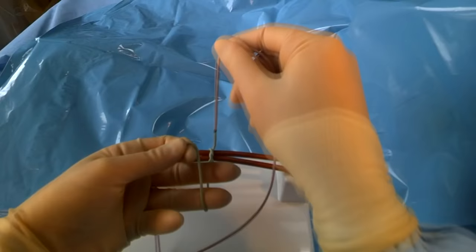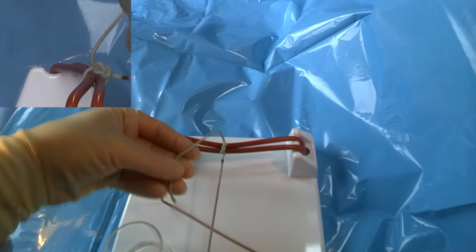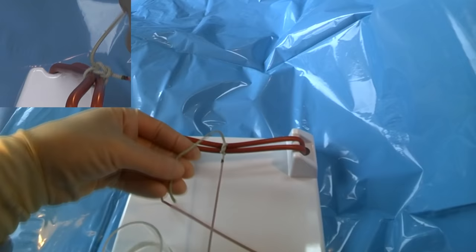And then we're going to bring the long thread down, again just the same, so short thread goes over, under, and down. Then just the same again: over, under, and down.